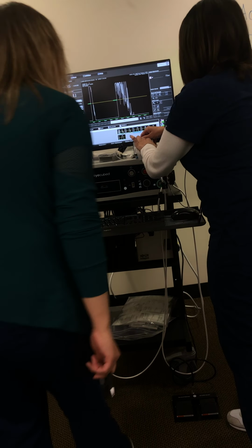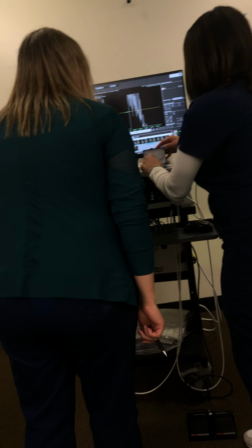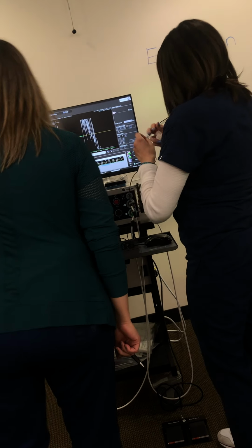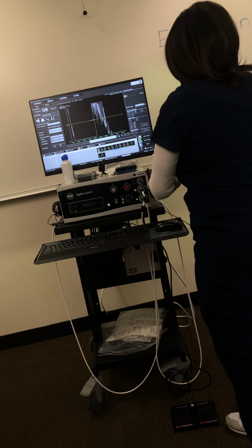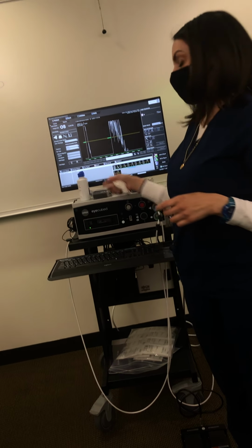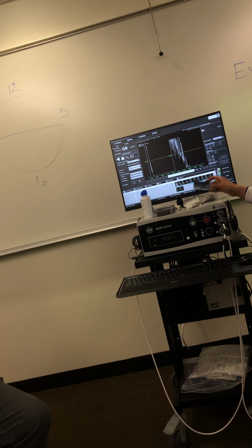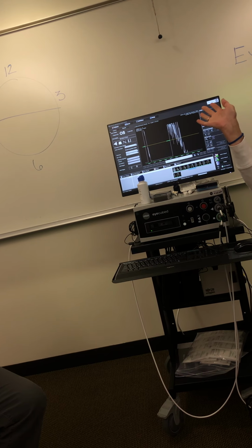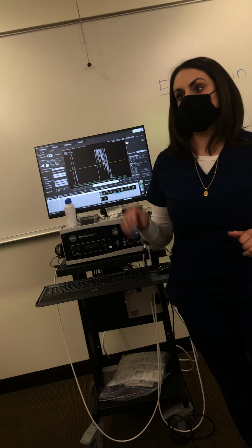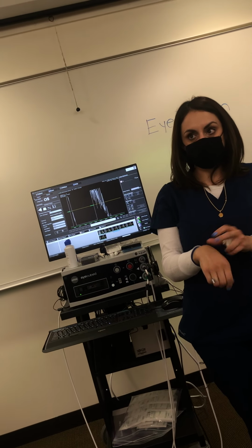She's just saying she uses that as a personal preference. If you like this one better, you can use it. I'm used to this one. But a lot of customers will call me and say the patient's eye is way over here, and you can't move this. No, you have to move the whole shell. With this one, you can customize it, but then you have to be very stable, because you are in charge of the angle of the probe. You want to be straight, right on top of the water. You don't have to go all the way through.